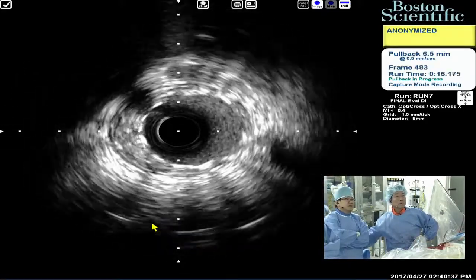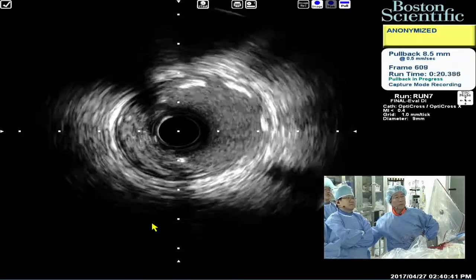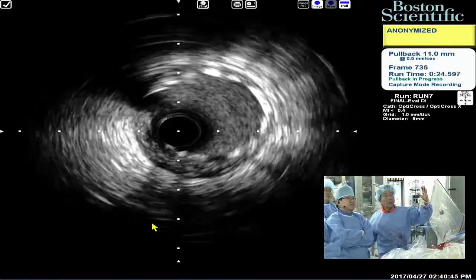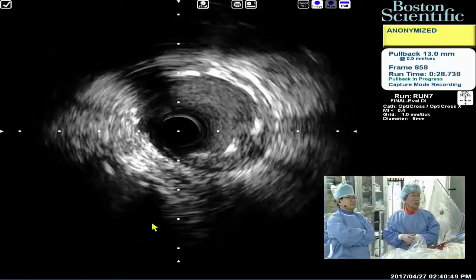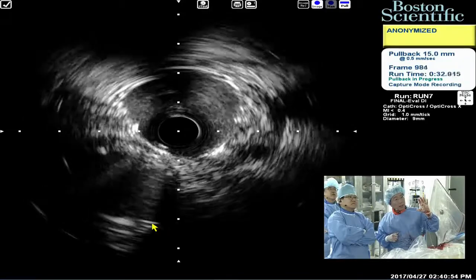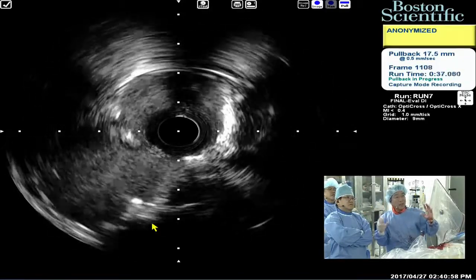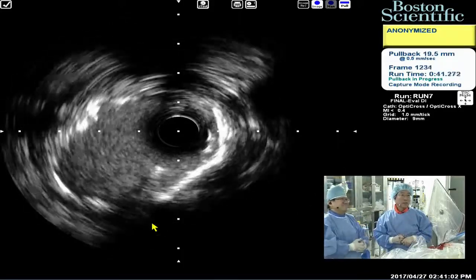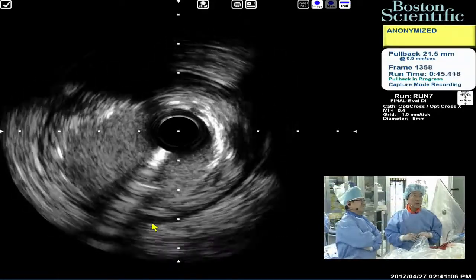2.5 here. 2.5. Standing at a 5 millimeter scale. And getting bigger. Yes. We did the high pressure inflation to 7.5. And so almost, okay, not yet. Ostial part here, encircling the well-expanded stent, longitudinal LAD, right? So I think imaging-wise it is almost perfect, right?